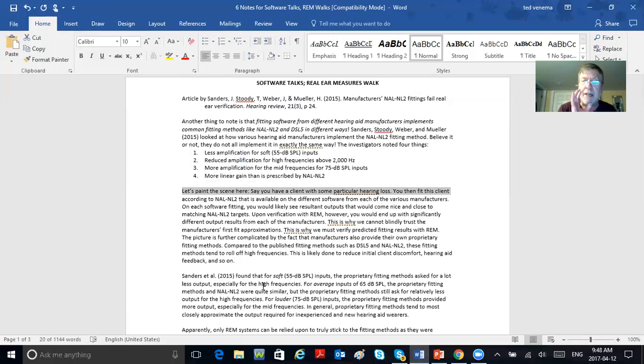So read that again. Let's paint the scene here. Say you have a client with some particular hearing loss. You then fit this client according to NAL2. And you've done this on Starkey, then you did it on Oticon, then you did it on Unitron, then you did it on Bernafon, all these ons. What's with all these ons? Anyway, all right.